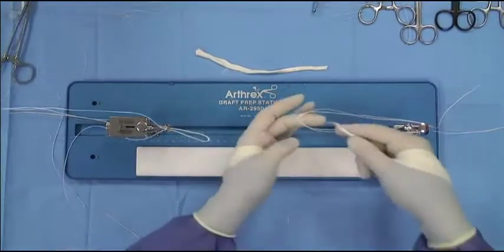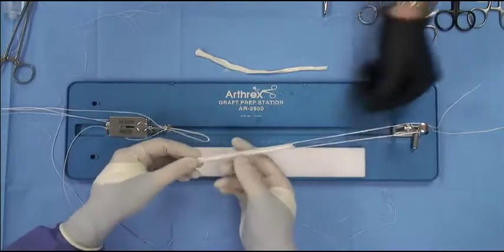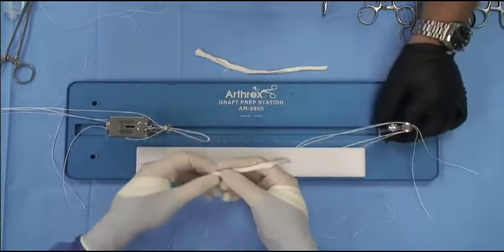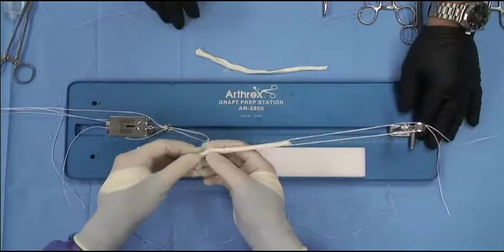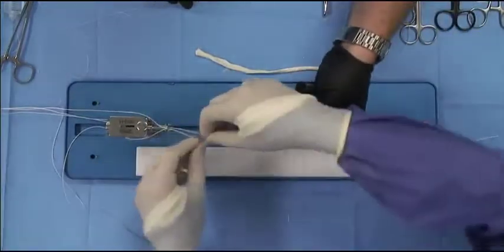Now what we're going to do is go ahead and pass it first on the tibia side. Then when we come back, the tibia might be a little smaller, which is anatomic. We'll keep this tightened down all the way right there. And in order, once you get these even, your assistant will pinch it right here, please, so they stay even.